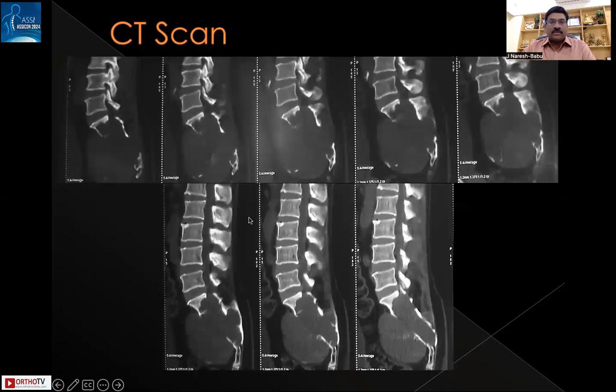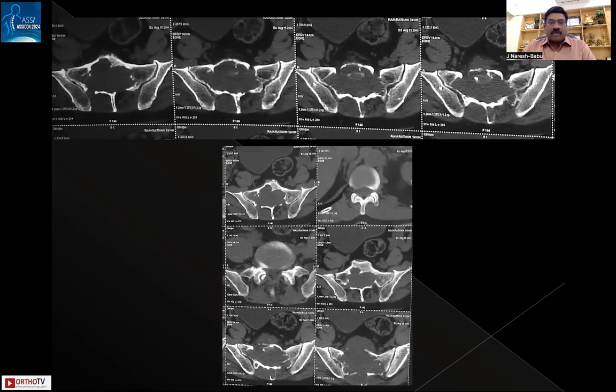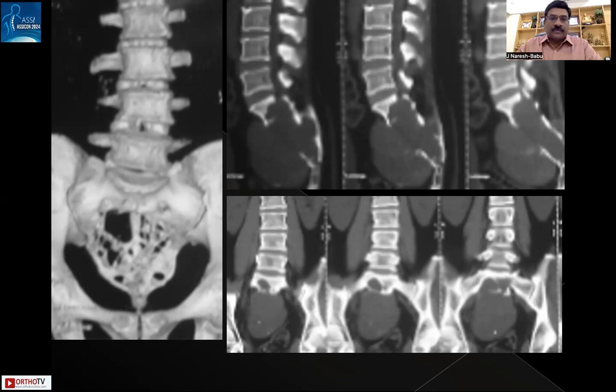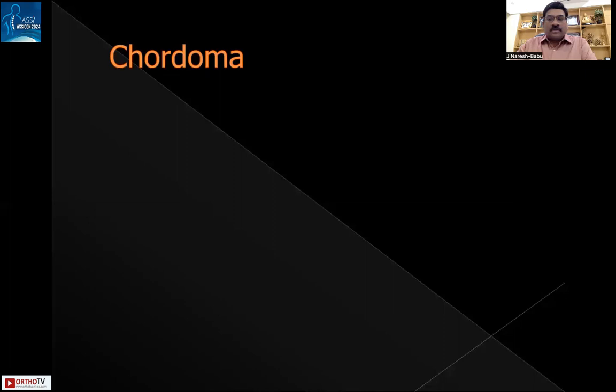These are the CT scan images of the same patient, showing destruction of the cortex anteriorly and posteriorly in the sacrum. The axial sections demonstrate how extensively the lesion involves the sacrum, and a 3D reconstruction further illustrates the different levels of involvement.